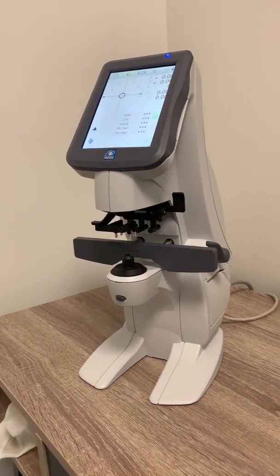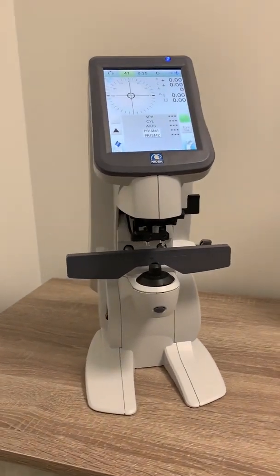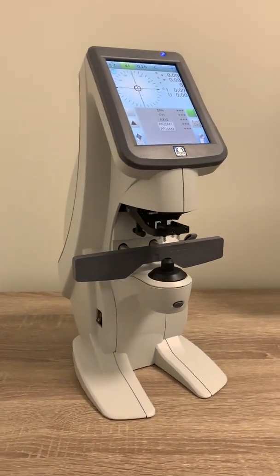The first piece that we're going to look at is the auto lensometer. This machine has the ability to actually determine what prescription is in your current pair of glasses. So regardless of whether or not we've seen you before, the machine spits out those numbers to tell us what your prescription is.